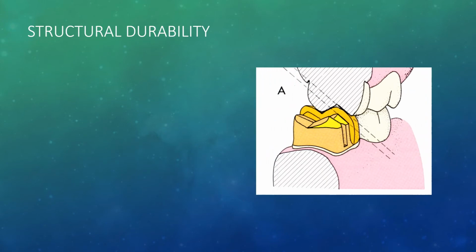As you see in this picture, there are different forces that will be present. As you are removing the occlusal surface, always follow the contour of the existing tooth. You have to follow the anatomy of the existing tooth, and as you see on the buccal surface also, there is an additional retention form, that is your proximal box, that is created for excess retention to increase the surface area. And also they have done a very clean and clear planar reduction.